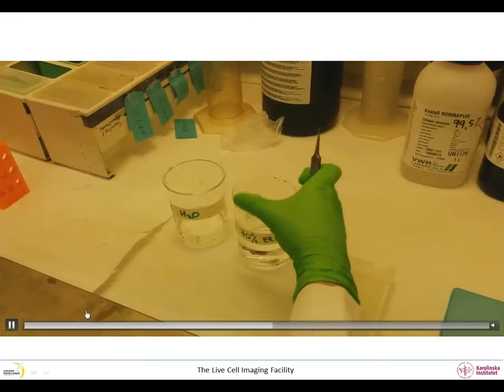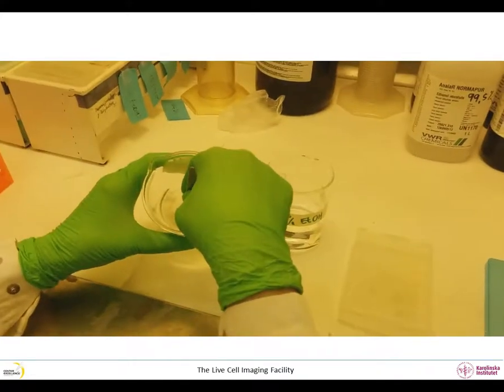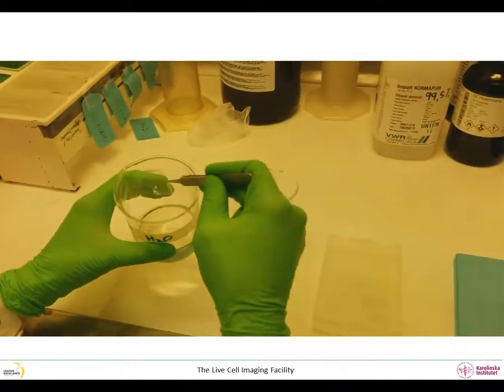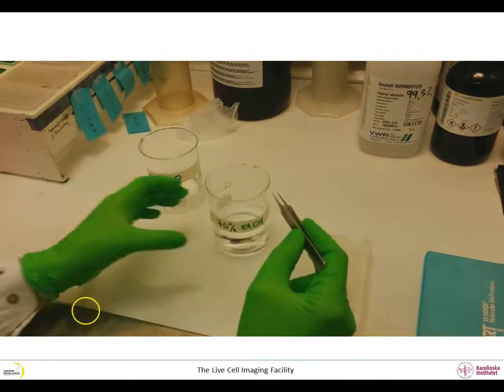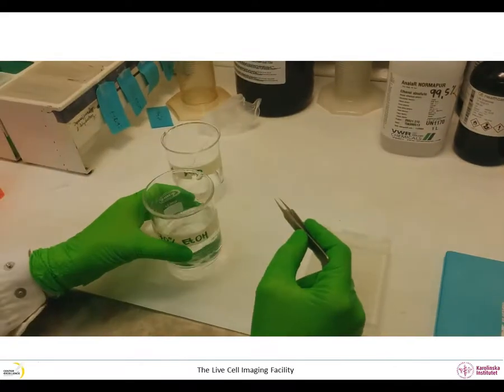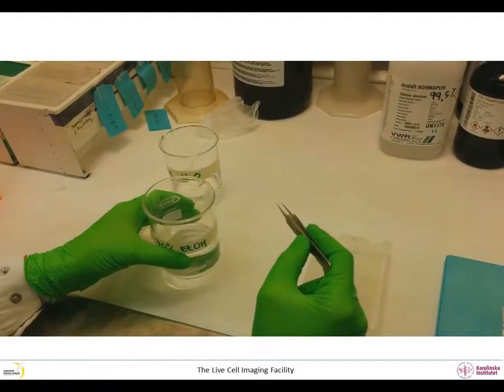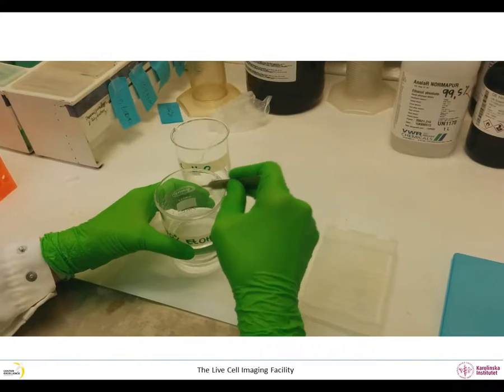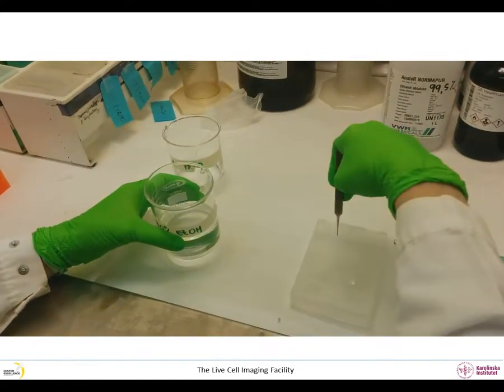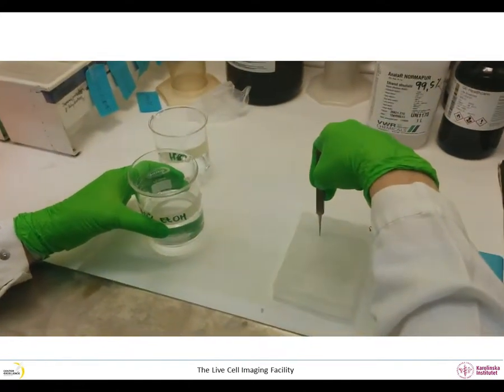To sterilize the cover slip, prepare a 70% solution of ethanol and transfer the cover slip into this solution. After a couple of minutes take them out and put them in a holder to dry. The cover slips are now ready to be used and the leftovers can be kept in a clean container.